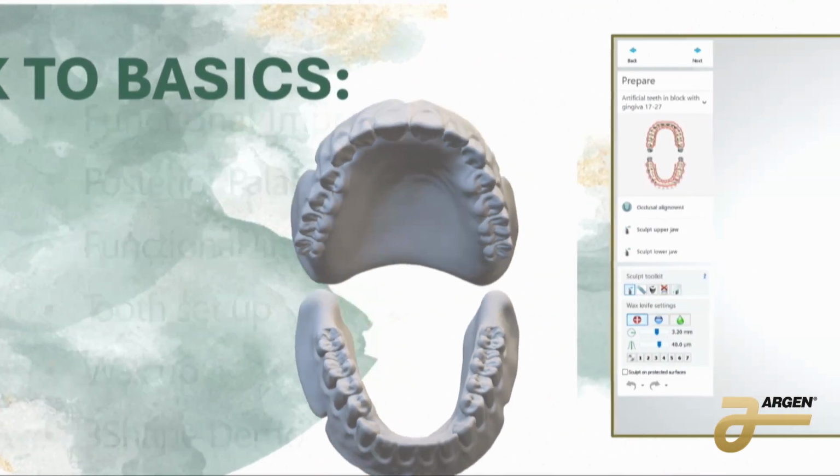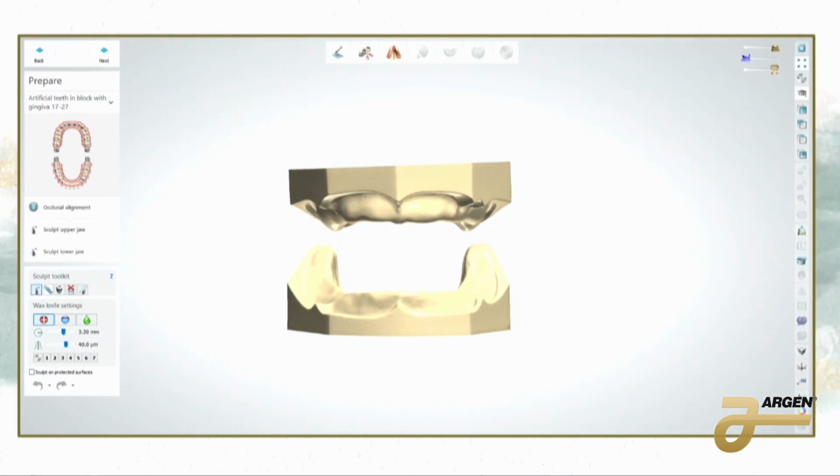At the end of this, we will do a 3Shape demo. I will open the software. I have my computer here, and we'll go through some demos together just to see how we can apply some of the things that we're talking about.